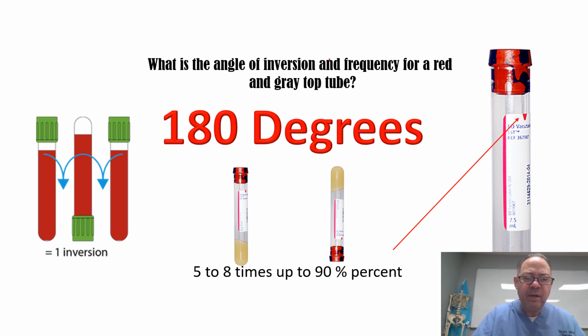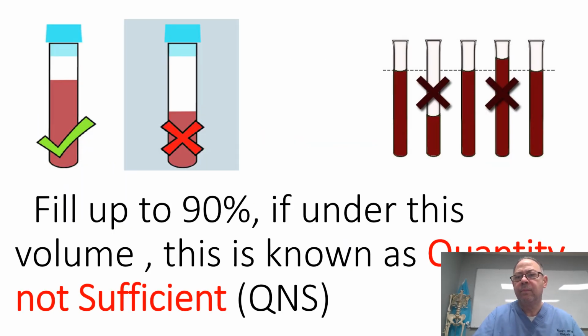Now, independent of that, I have seen many, many phlebotomists or doctors that as soon as they take the blood, they centrifuge right away. No, don't do that. The clotting does not accelerate the timing. It makes sure that the clot occurs. Totally two different things. So, recuérdate, doctor, o enfermera, cuando tú sacas sangre con ese tubo Gold, tú no centrifugas inmediatamente, tú esperas entre 20 a 30 minutos. Que sea un activador de coágulo es una cosa y que haga el proceso completo es otra. Por eso hay que esperar de 20 a 30 minutos.